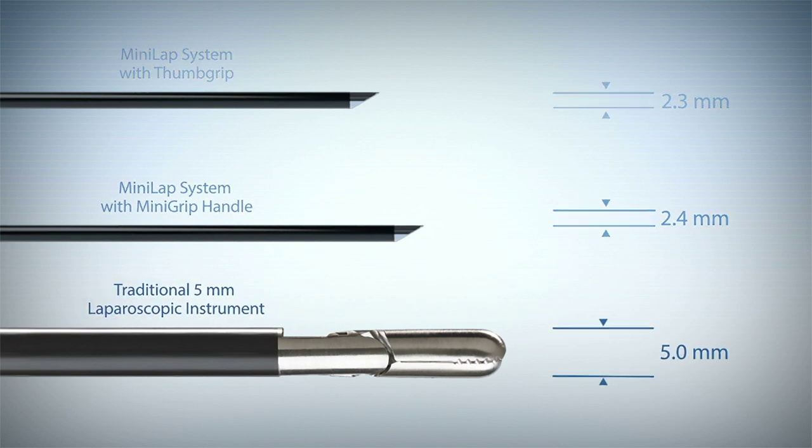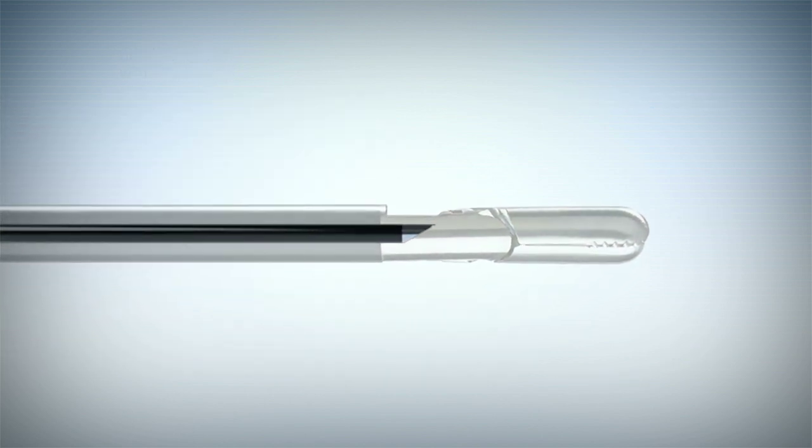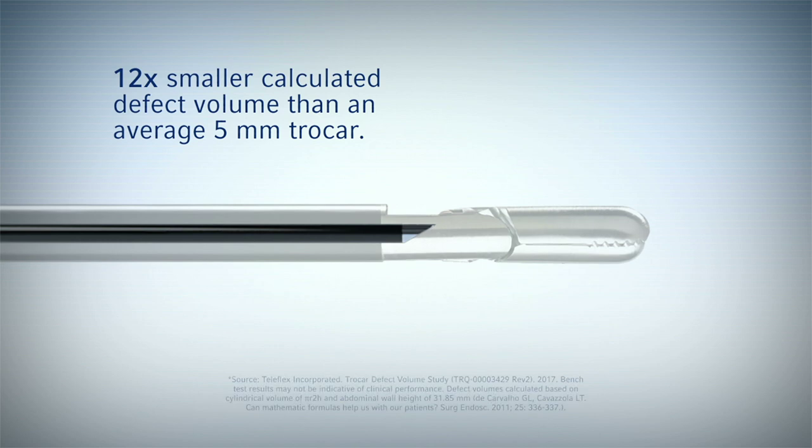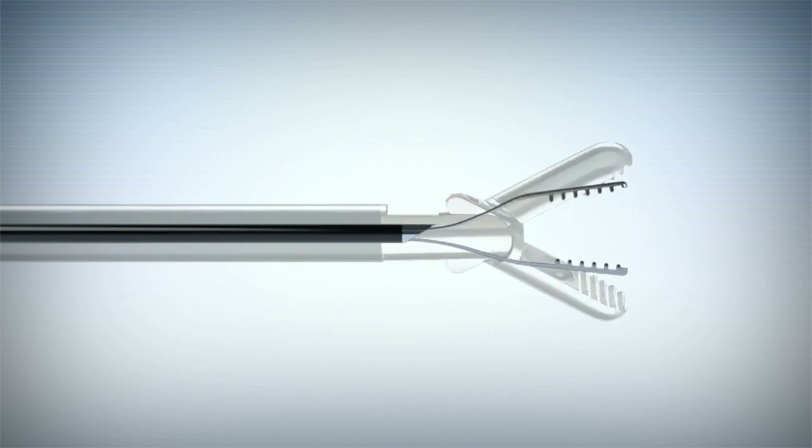The Minilap percutaneous surgical system has a calculated defect volume that is more than 12 times smaller than an average 5 millimeter trocar. The device's patented deployment design allows the grasper jaws to open up to 12 and a half millimeters, and the proprietary steel shaft provides the strength and rigidity necessary for secure tissue retraction.